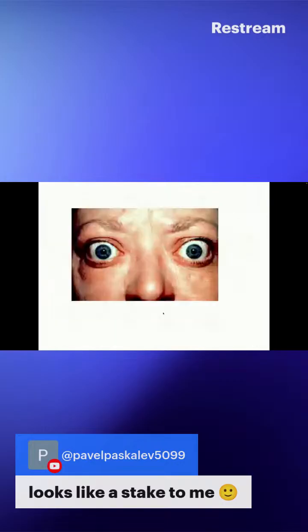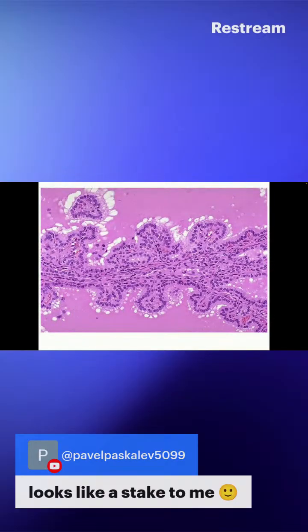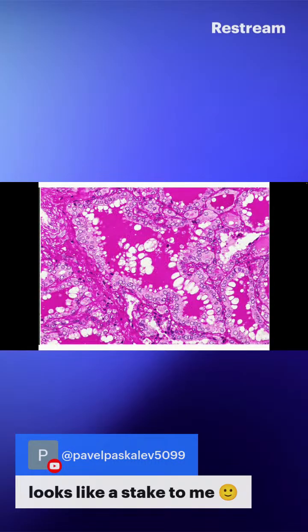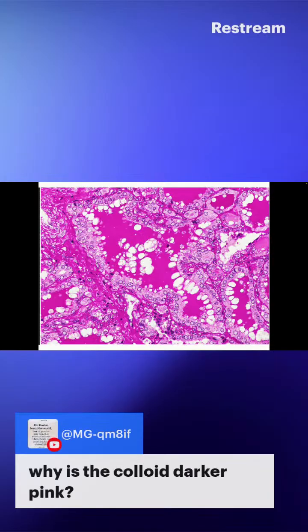I'm just going to show you the epithelium again. We said that this is cuboidal, and you have the nucleus in the center. But here it becomes more columnar. If I can convince you that this looks a bit columnar, and the nucleus is a bit on the basal side.